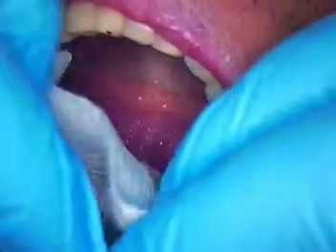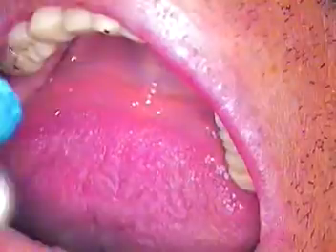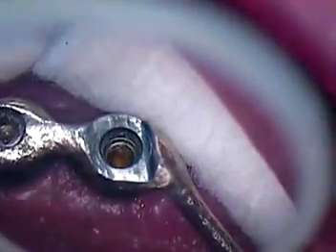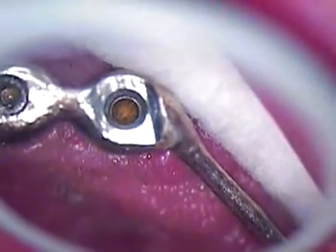So we'll go right in with two new cotton rolls. We're going to go right ahead with the cavity cleanser. That's first. And then we'll go right in with our tartar and stain cleaners. And then we go through an assortment of brushes, folks. We've got bristle brushes. We've got little trees, little proxy brushes. So we're going to go right through, leaving everything in position now. And let's look real close. If I just go in very, very gently with the perioprobe, I'm just going to stir it up a little bit first. You can see the debris inside.